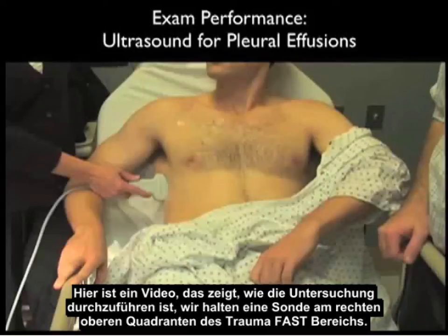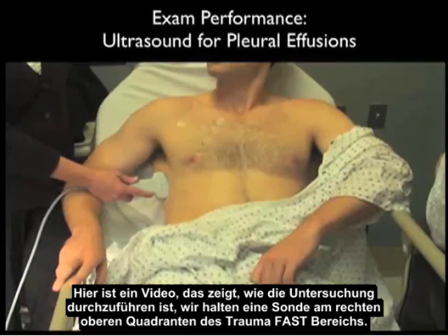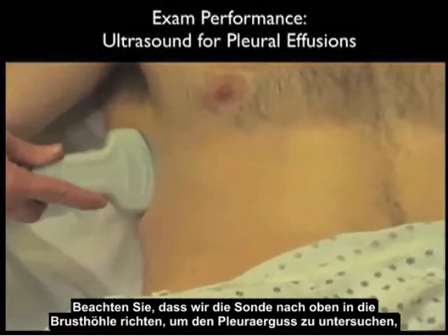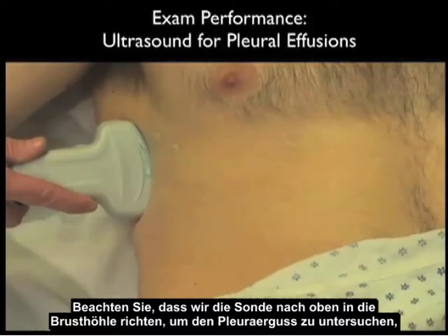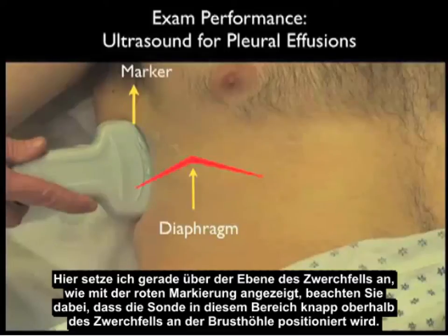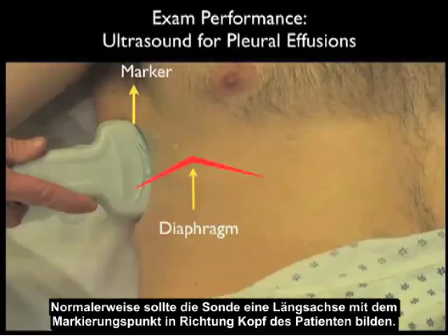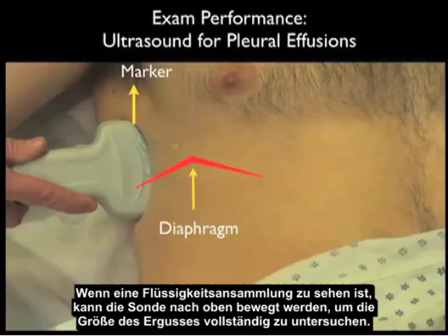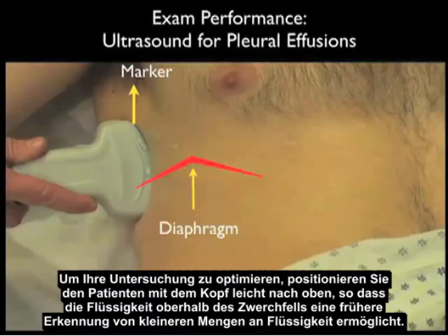Here's a video going over how to perform the examination. Notice the probe placed into the right upper quadrant trauma fast area, angling upwards into the thoracic cavity to fully investigate for a pleural effusion. Here I'm superimposing about the level of the diaphragm as shown in the red marker, and the probe is positioned coming into that area just above the diaphragm into the thoracic cavity. Traditionally, the probe should be in a long axis configuration with the marker dot towards the patient's head. If a fluid collection is seen, move the probe upwards to fully investigate the size of the effusion. To optimize your examination, place the patient with the head slightly upwards so that the fluid will layer out above the diaphragm, allowing earlier detection of smaller amounts of fluid.